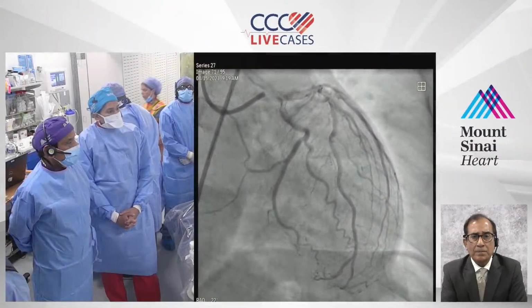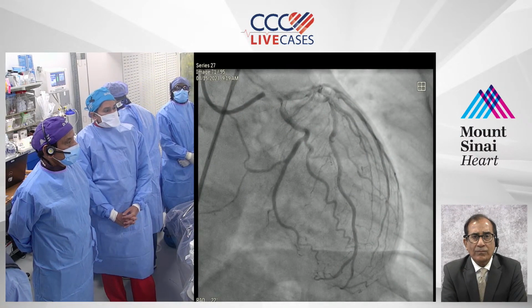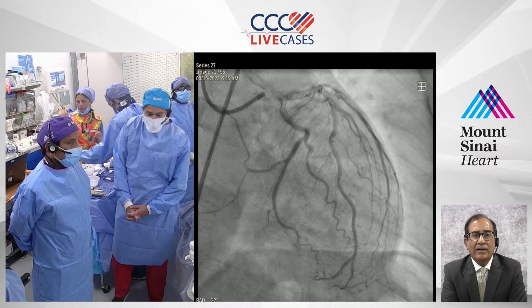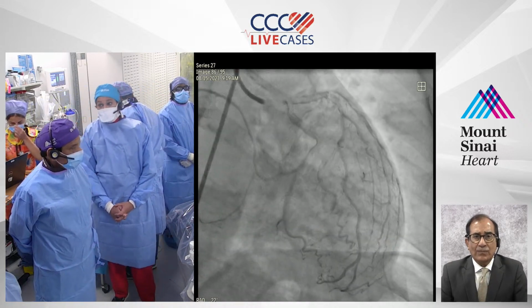So contrast volume. Oh, sorry. Go ahead, Anu. You can tell us. Contrast volume was 120 cc, and total fluoro time was 33 minutes 23 seconds. Air kerma of 1.5. Wow. We always goal that the air kerma should be less than 2.